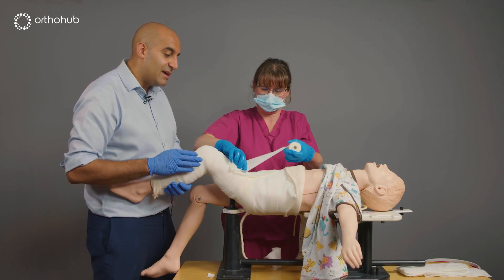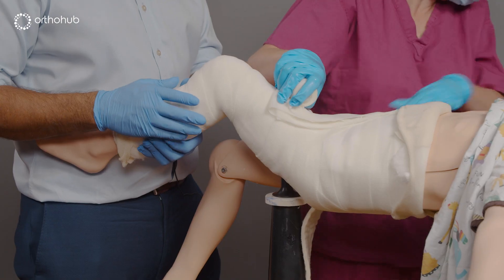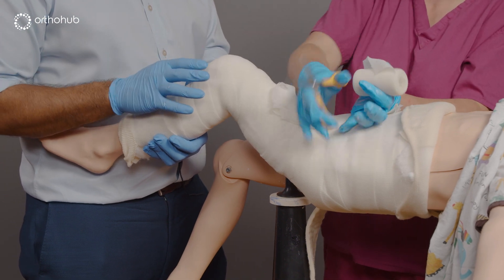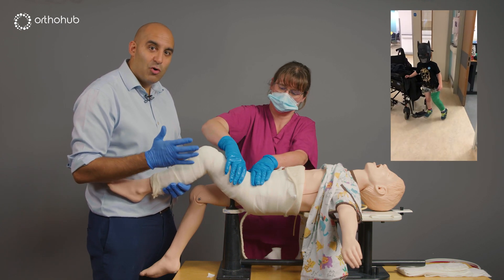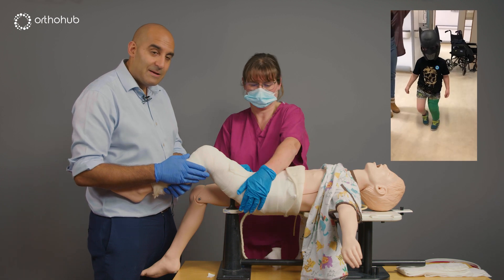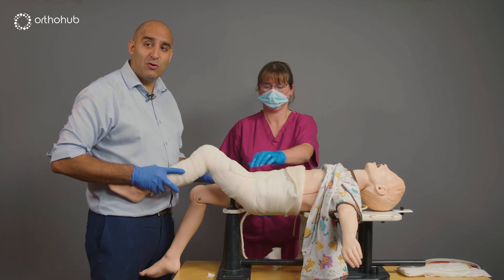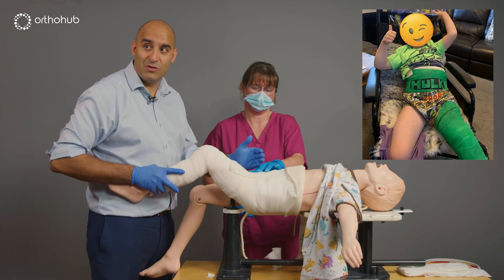The joy of this technique is that children tend to walk very early — we've had many children walking between three and four weeks post-op on the fractured limb. Having the unaffected limb free of plaster allows children to weight bear, pivot, and transfer, which significantly reduces caregiver burden. They're able to toilet themselves, get up from bed and from a chair. Children will increasingly test by putting their foot down on the fractured side and start walking. They can also wear a nappy over the cast, or pull up pants if potty trained, since only one leg is affected.